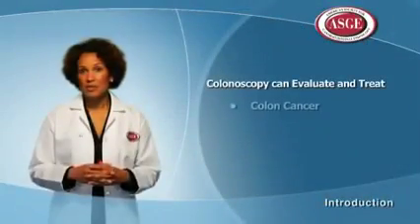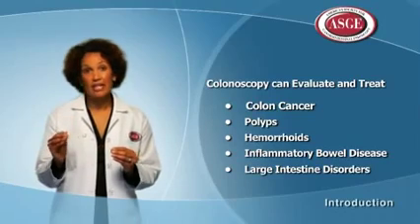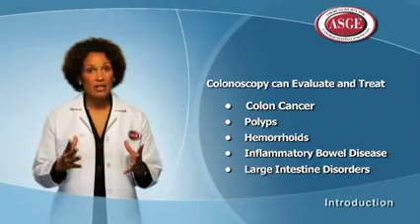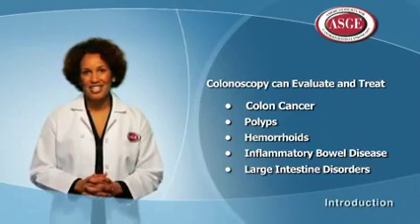While colonoscopy is most commonly used to look for colon cancer, or more ideally, polyps, which are small growths in the colon that can eventually turn into cancer, colonoscopy can also be used to evaluate and treat many other diseases, like inflammatory bowel disease, hemorrhoids, and other disorders of the large intestine.